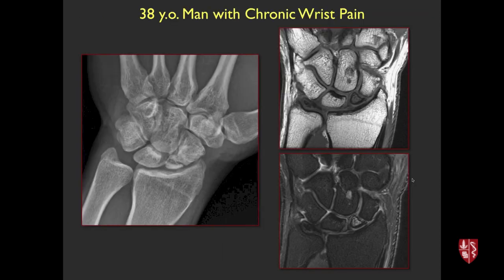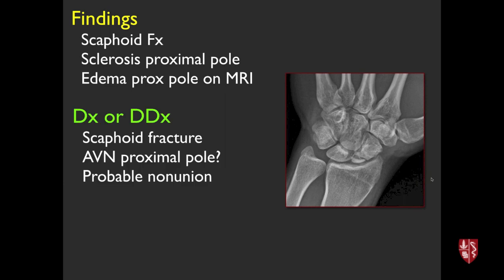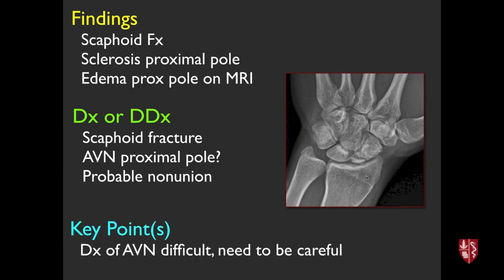38-year-old with chronic wrist pain. Sclerosis within the proximal pole of the scaphoid, a lucent fracture line, and edema in the proximal pole on MRI — this is a scaphoid fracture, probably a non-union given the chronic appearance. The sclerosis of the proximal pole may represent AVN. IV contrast is sometimes needed to assess whether the bone enhances, because true AVN means the bone cannot heal, whereas some residual vascularity may allow healing with appropriate surgery.